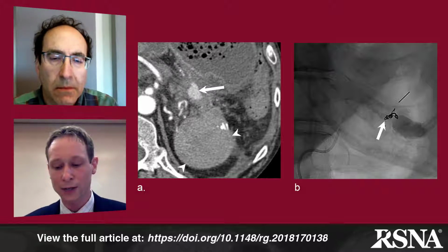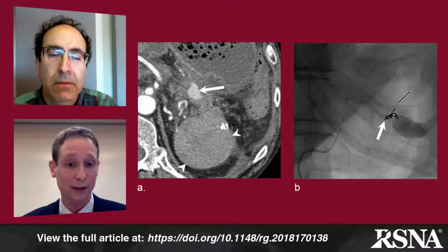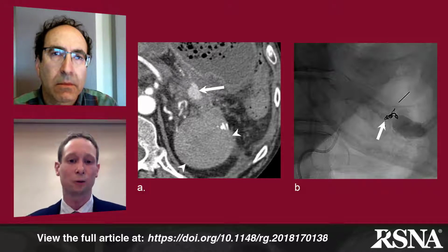At the hospitalization that these images were acquired on, he presented with melena and some question of hematochezia. And so he underwent colonoscopy and upper endoscopy. The colonoscopy was negative for any potential source of bleeding, and the upper endoscopy only showed his previously injected gastric varices. And again, no evidence of active bleeding. In the hospital, he continued to have melena and then had an acute drop in his hemoglobin, and so his primary service ordered a CT angiogram.